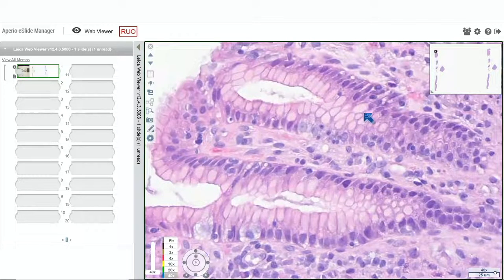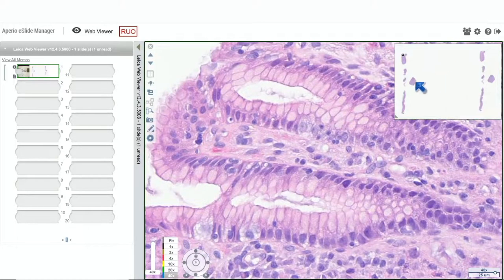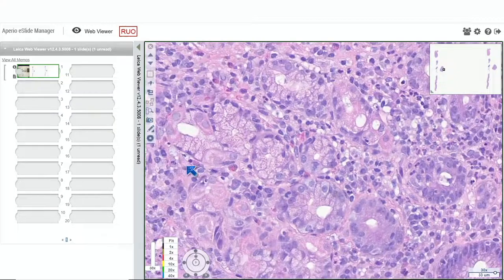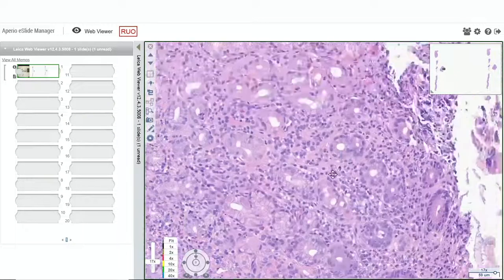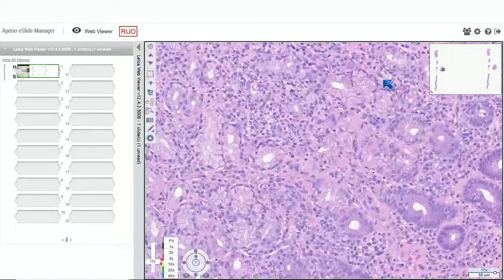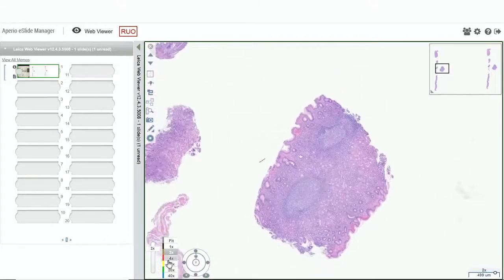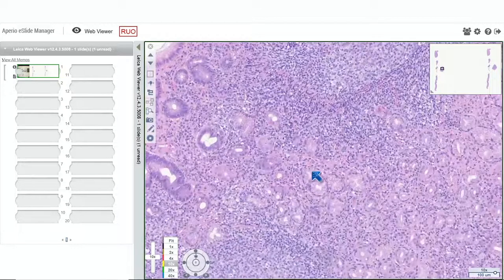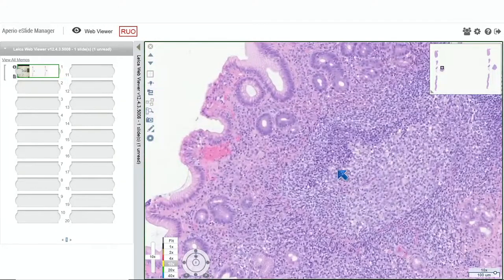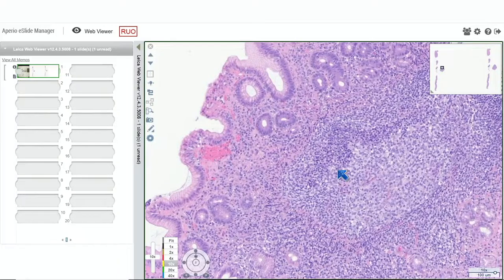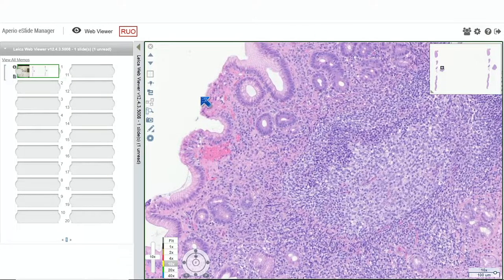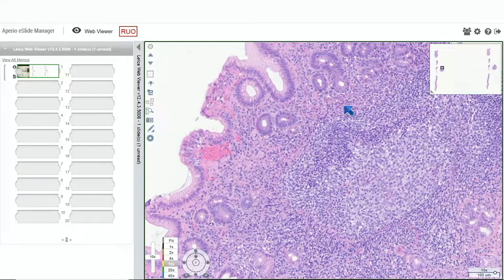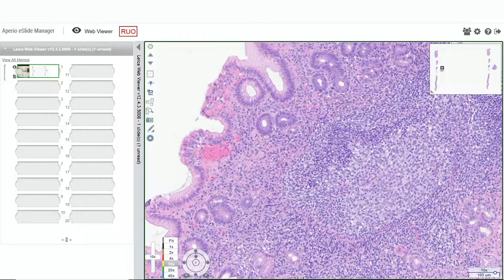This first case is just a pretty straightforward example of H. pylori-associated gastritis. I'll just mention that in a biopsy, when you see lots of lymphoid aggregates, like we have here, with germinal centers in the antrum, it's almost always going to be H. pylori-associated. So if you don't do upfront stains or H. pylori immunostains, and you don't see bacteria in a case like this, this would be a situation in which you'd want to order those stains.